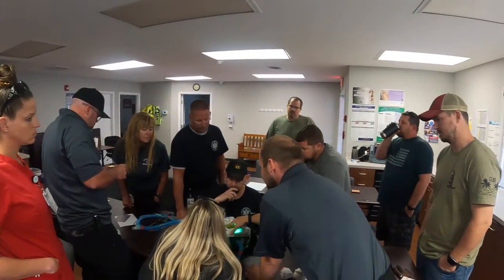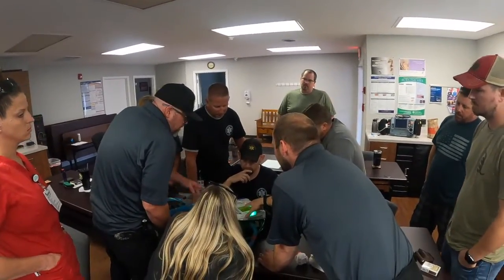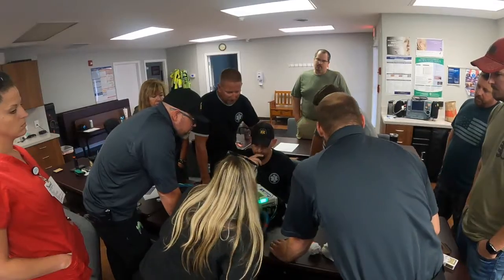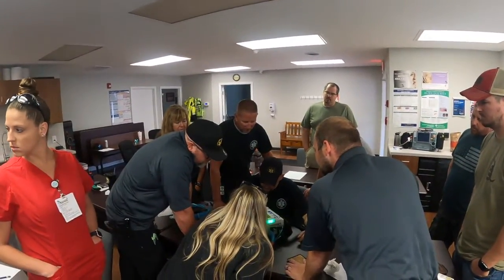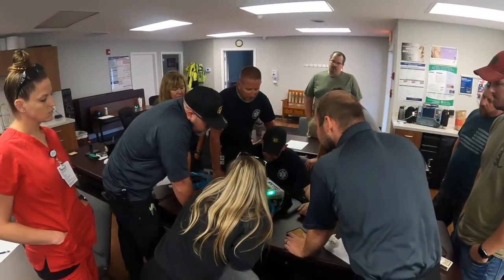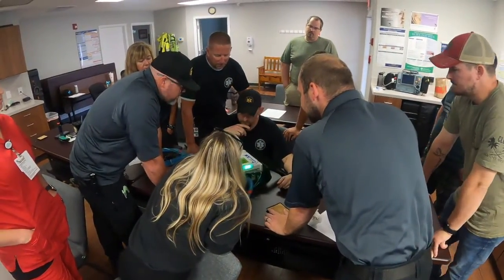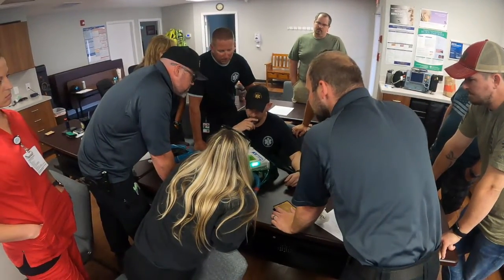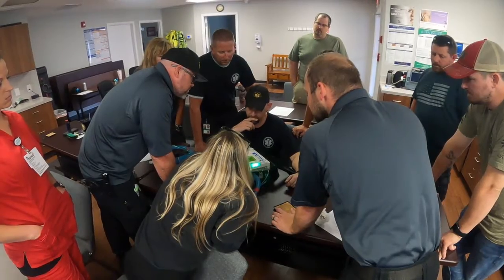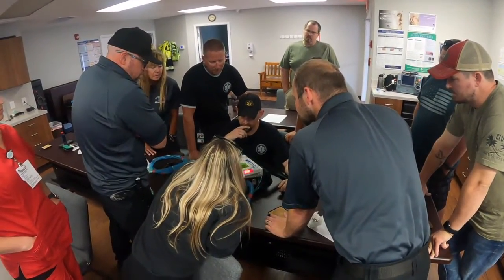Breaths per minute, not too bad. I to E ratio is 1 to 2. Okay, go ahead and change it to 1 to 2.5 and see what happens. What happened? This one goes up to 6.2, and that's 660. See, it's giving me a lot for that, so some people just go straight to that instead of looking at the 850.